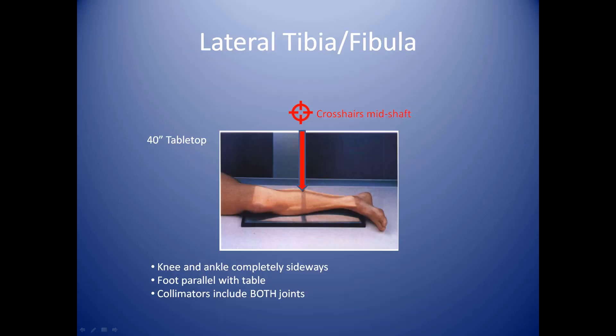For the lateral tibia fibula, or tib-fib, your cassette is underneath the patient. You have the patient lying on their side. Your camera is 40 inches away from the cassette, above the cassette, and your crosshairs are centered mid-shaft of the leg. The main thing you want to do is make sure that your knee joint and foot are parallel to the cassette. Your foot is completely sideways. You also want to make sure that your leg is slightly flexed, as this helps to encourage laterality.